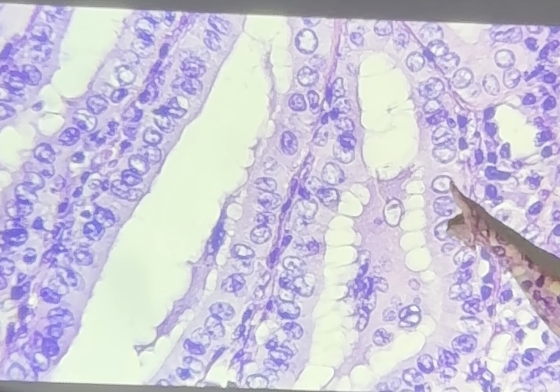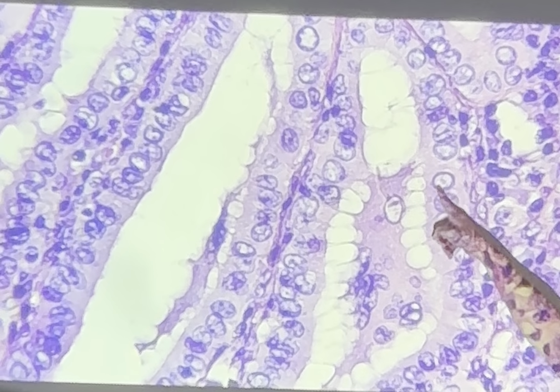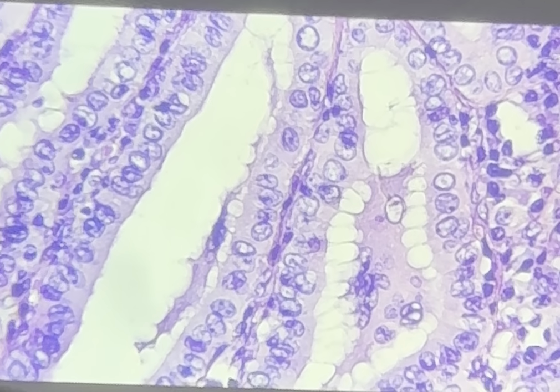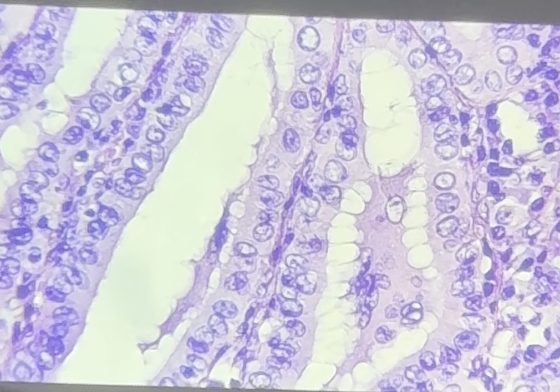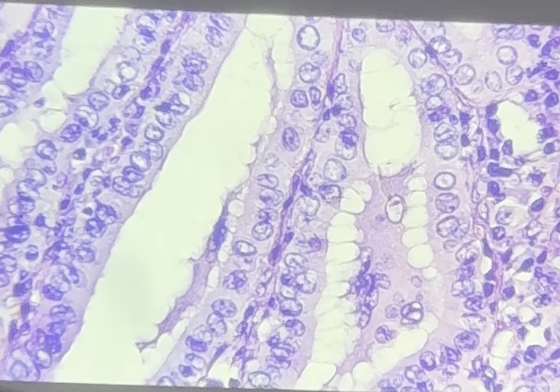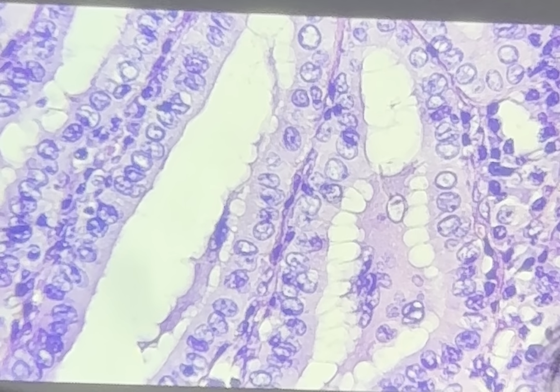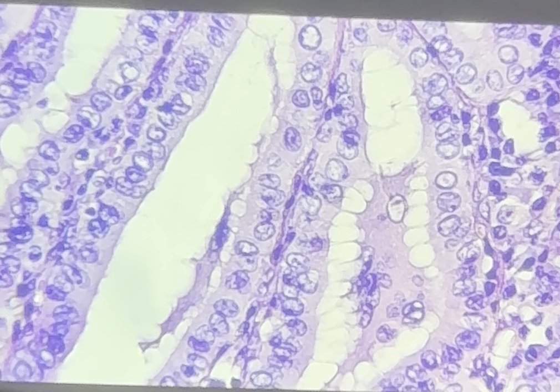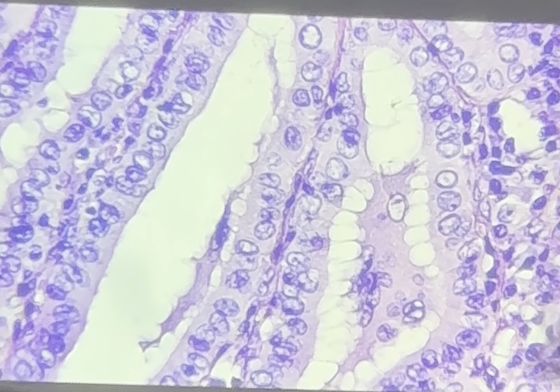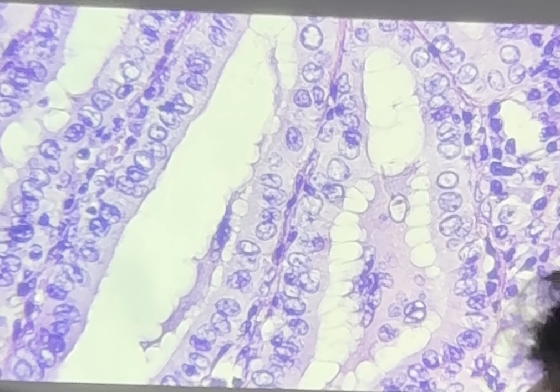The nucleus is what we call optically clear, or ground glass, or the other term is the Orphan Anne nucleus. Orphan Anne is actually from a very old comic strip. She was an orphan, and her name was Anne. So hence Orphan Anne. And when they drew Orphan Anne, she had these big, wide, white eyes and a very small little pupil like this. That's the Orphan Anne.